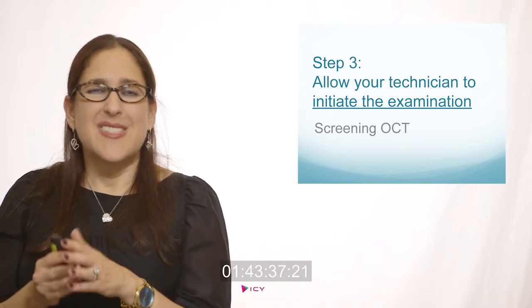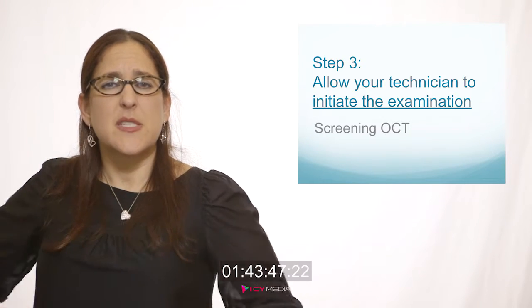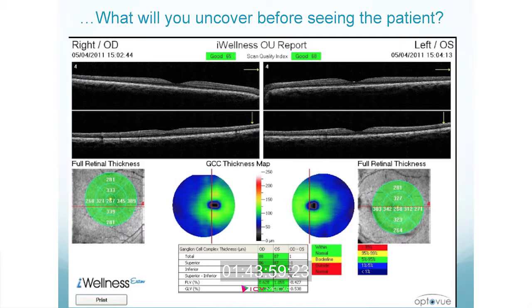So you have to understand that these conditions are not black and white. And I'm going to try to go through examples in this webinar of acute and chronic situations of optic disc edema. Because the screening OCT gives us some information, but it's not going to give you the whole picture. You're going to have to move forward and kind of hone in on the test that you want to do to help you arrive at the final diagnosis.